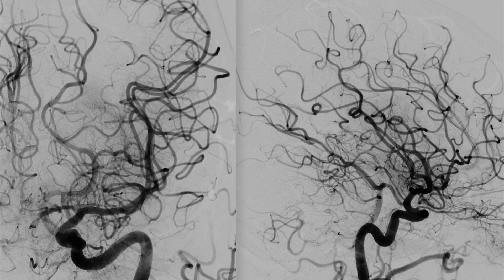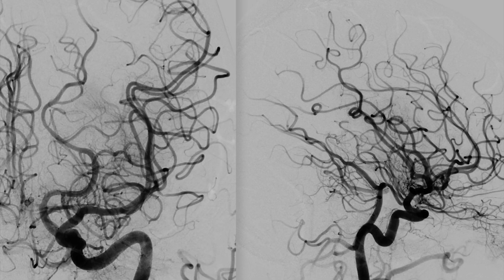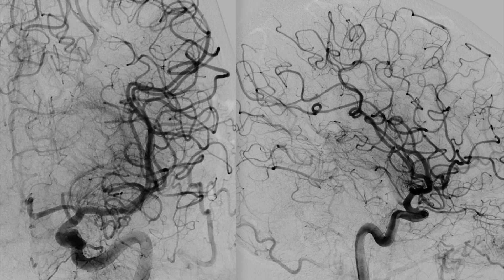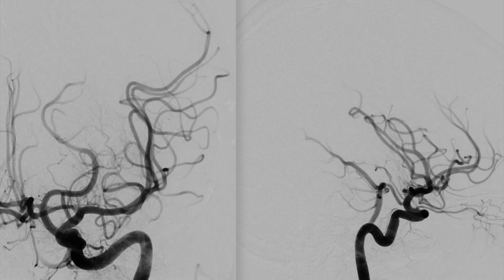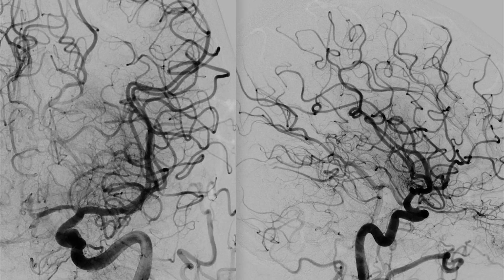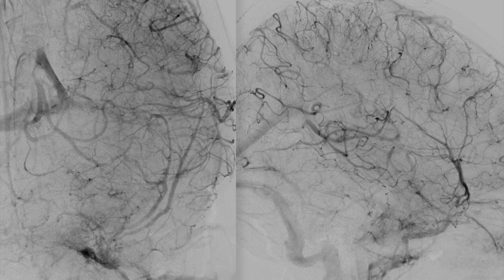This is the process as you can see here, and with this we remove the clot. We have published this in the past and have good first-pass results. In our first series, the entire procedure from stent retriever placement to recanalization — including simultaneous treatment of the carotid stenosis — took only seven minutes. As you can see, we achieved a very good result after one pass: full recanalization of the intracranial LVO and successful dilatation and stenting of the carotid lesion.